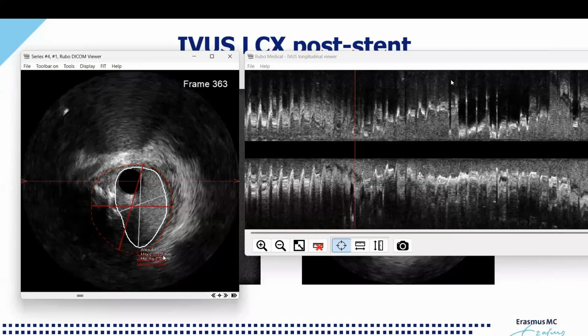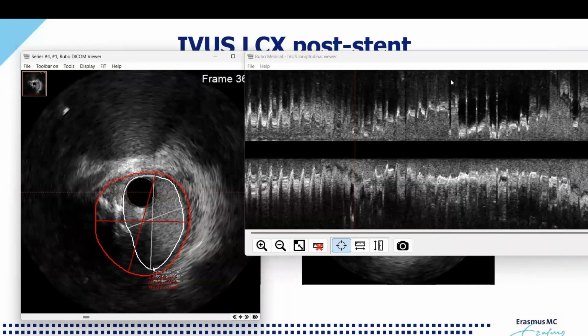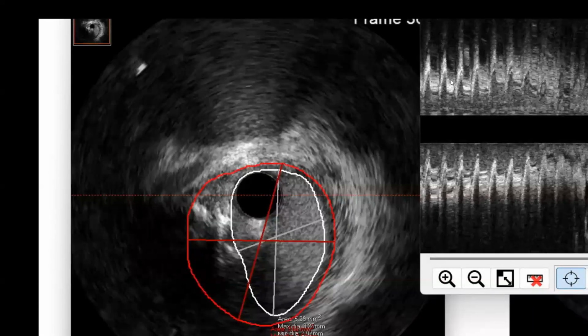Oh, that's red. I will make it a bit bigger. You need to call Rutger, Jurgen, so that he changes the colors, because this annoys me also all the time. But this is clearly more than 50%. Yeah. I think this is.